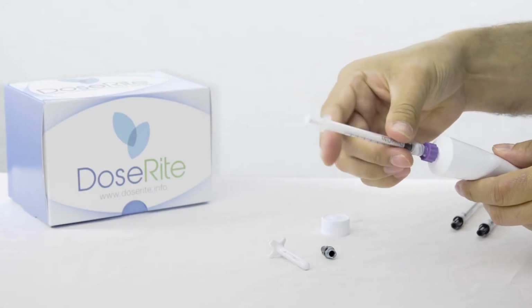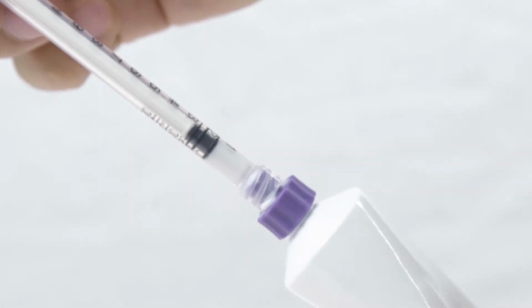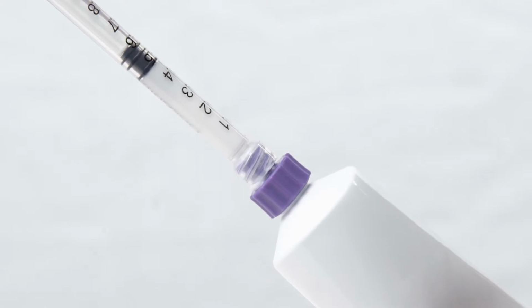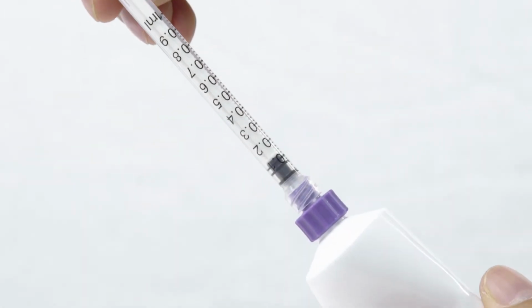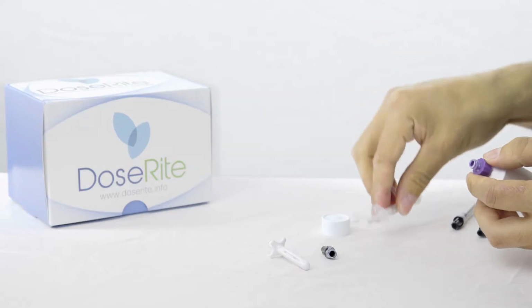Attach a dosing syringe to the adapter until tight. Begin dosing by slowly pulling on the plunger until the medication reaches the prescribed level. If medication fill is incomplete, remove the syringe and reprime the tube. When the dose is complete, remove the syringe and place cap on the adapter.